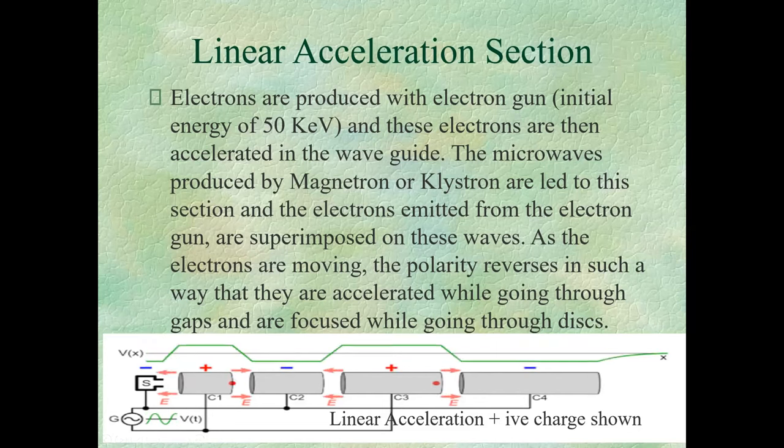So these ion chambers keep an eye on the accelerator. After passing through the flattening filter, the beam is then incident on those monitoring chambers. These chambers are usually transmission type. So again, they are transmission type.